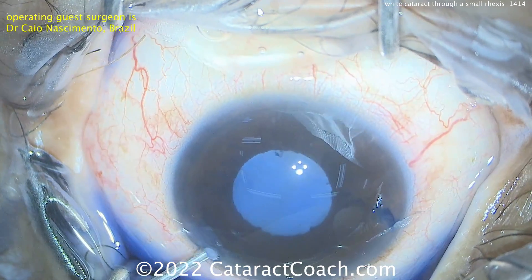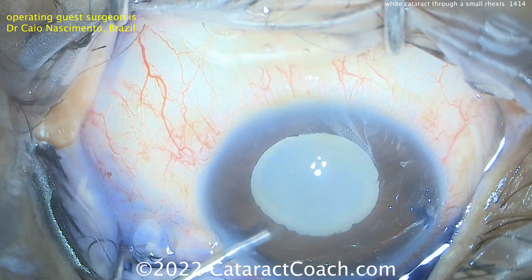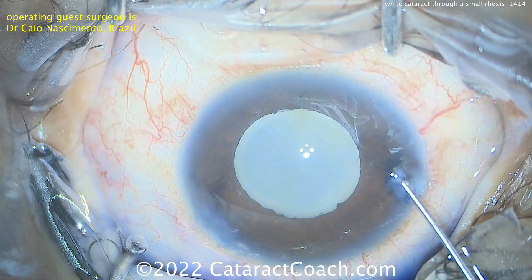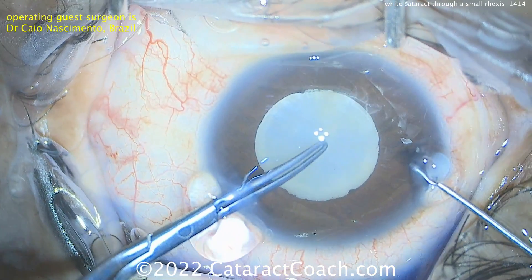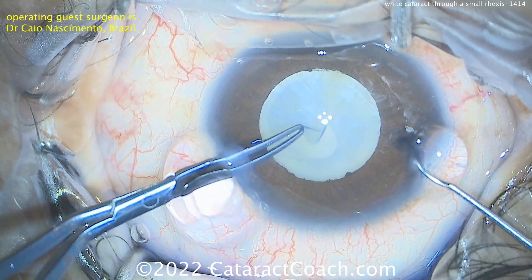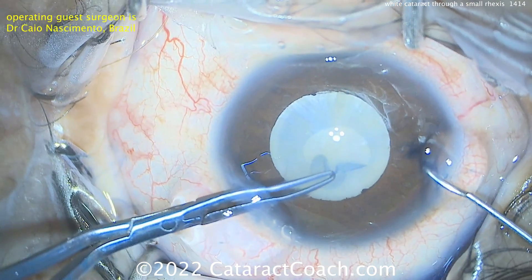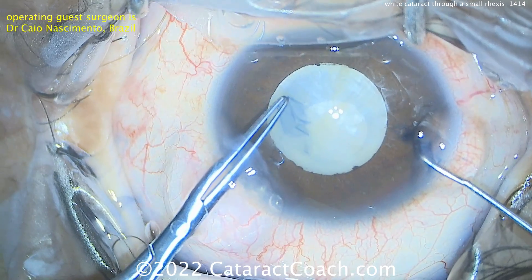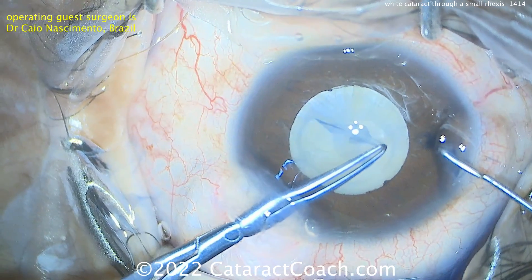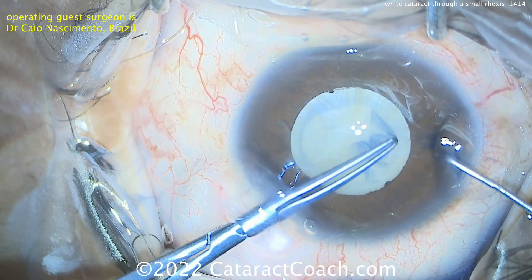Perfectly acceptable — do whatever's in your comfort zone. So now here's the viscoelastic going inside the eye. Dispersive viscoelastic. Now the pupil got a little bit bigger there, so probably about a four and a half millimeter pupil. Fixating the eye and going in with the forceps. So if that's a four and a half millimeter pupil, that's a much smaller rhexis. And now a spiral technique — I like the spiral technique. You can see there's not too much intumescent lens milk or lens fluid leaking out, so he's going to enlarge that rhexis by doing that spiral technique and bring it out.